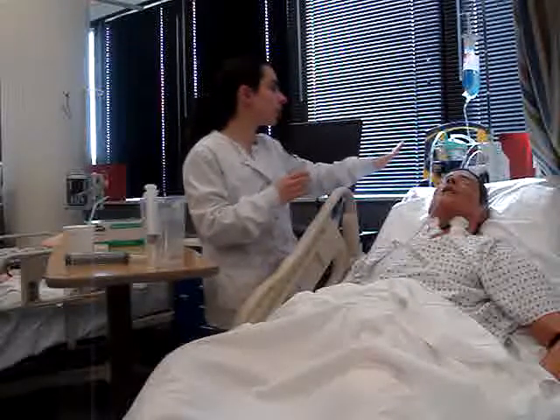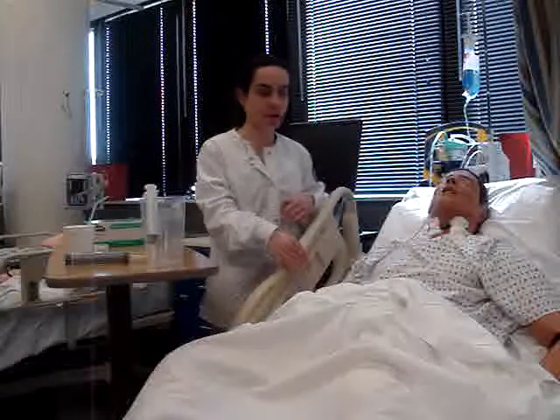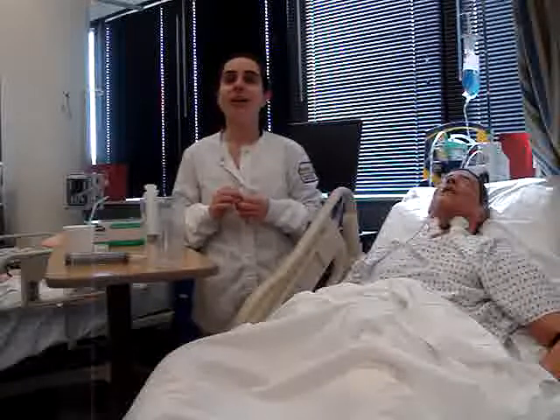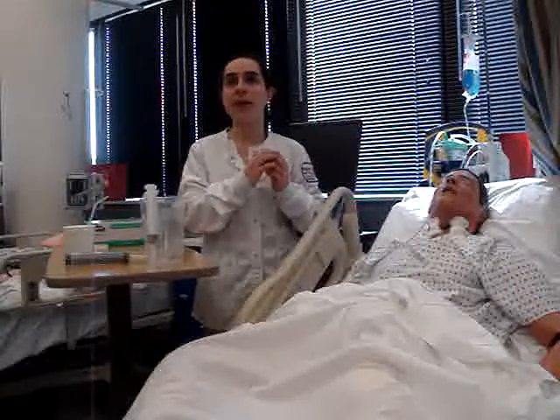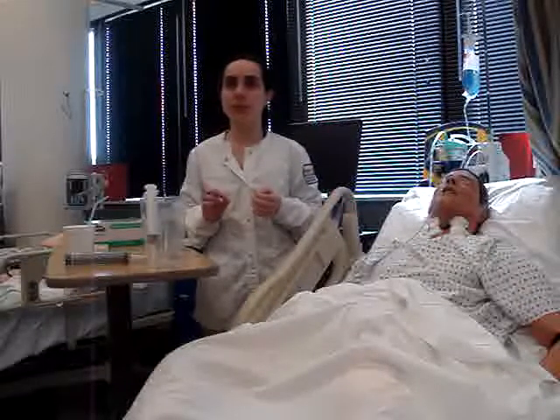What I want to do is put warning labels on the tube itself and on the tube that is coming from my pole, and I'm going to put a sign that says warning, only for enteral feeding, no IVs. I'm going to hang the bag on my IV pole at least 12 inches above the stomach, and I will clamp the tubing.